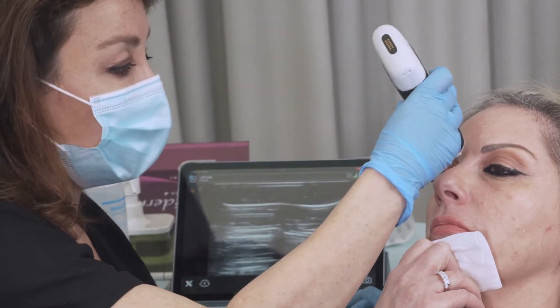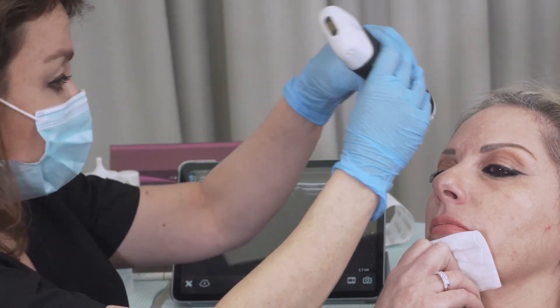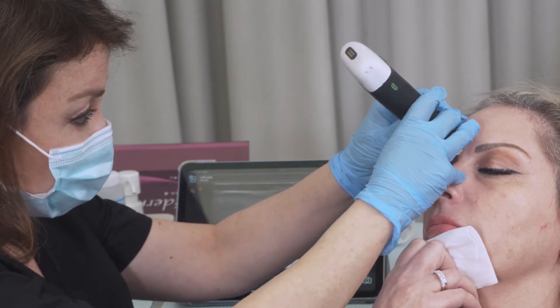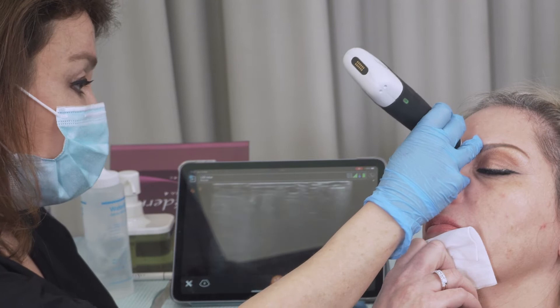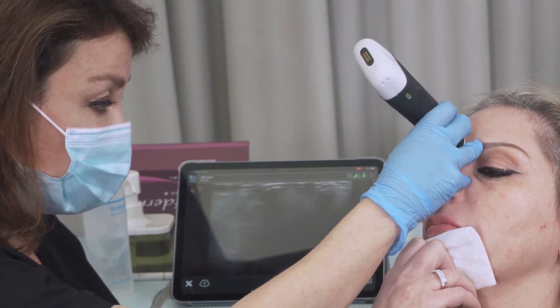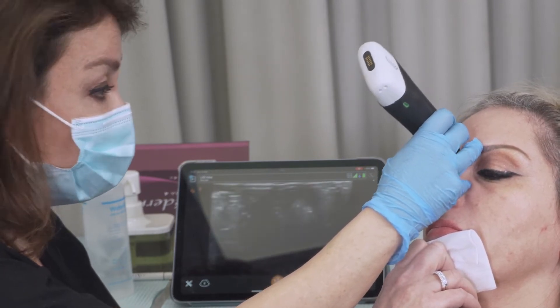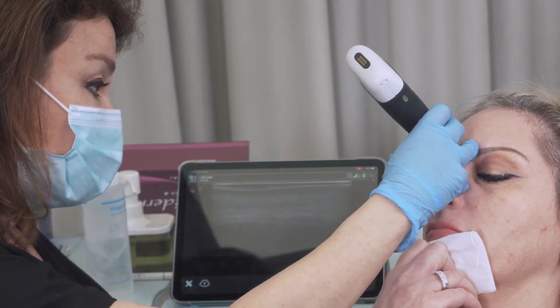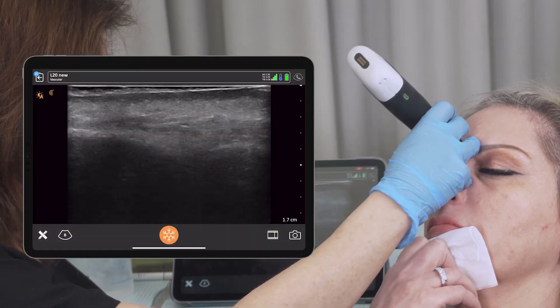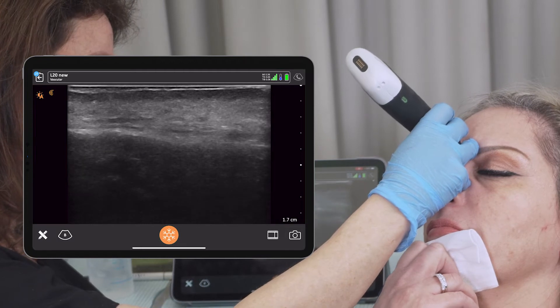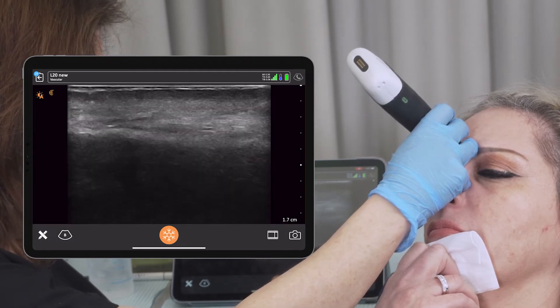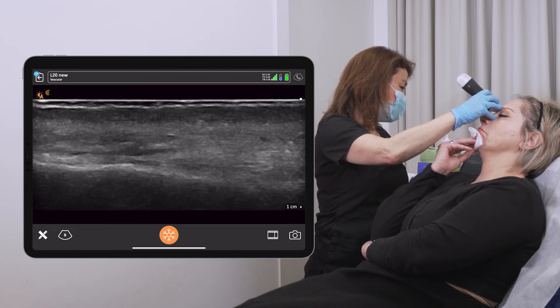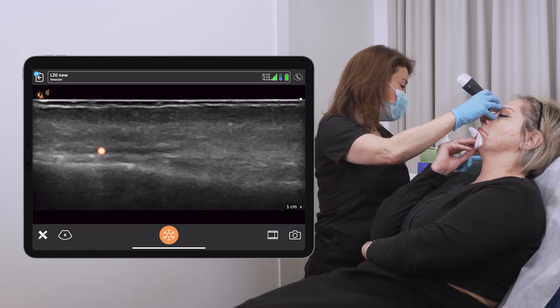We'll start with B-mode ultrasound. In this area we can see the skin, and the muscles — specifically the procerus and corrugator. We can ask the patient to frown and contract, and you can observe the muscle contracting on the image, then releasing.